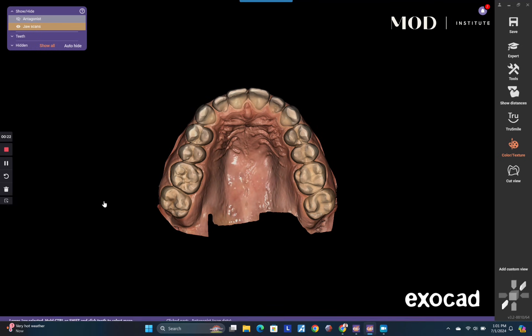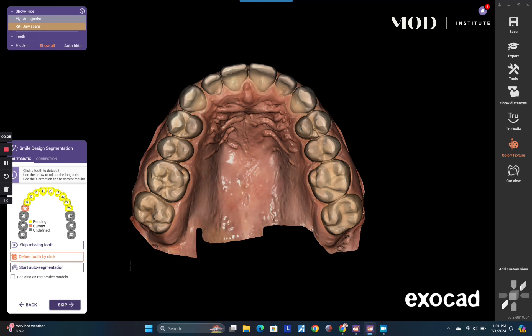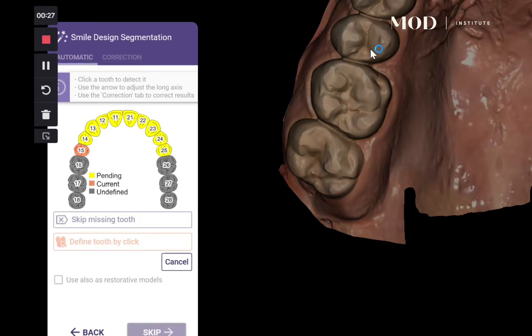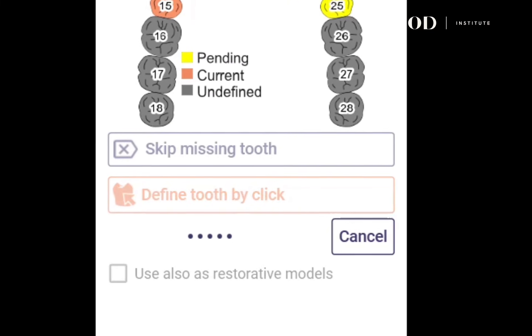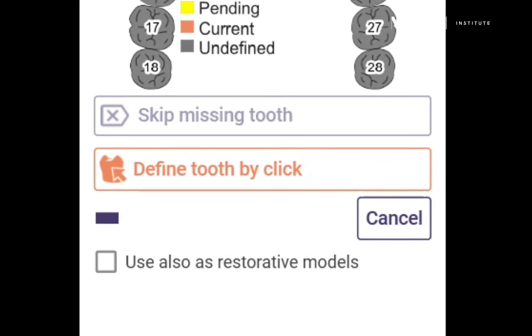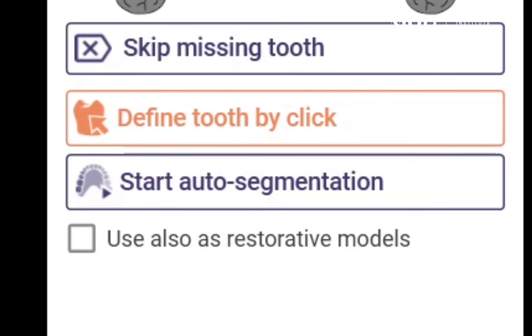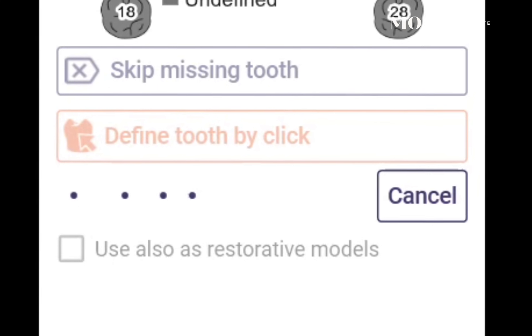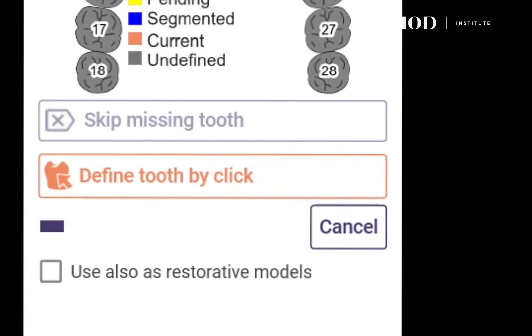The very second tab you're going to find is a button called 'Start Tooth Segmentation.' In the options you can define a tooth by clicking on it, or you can hit the auto segmentation button.